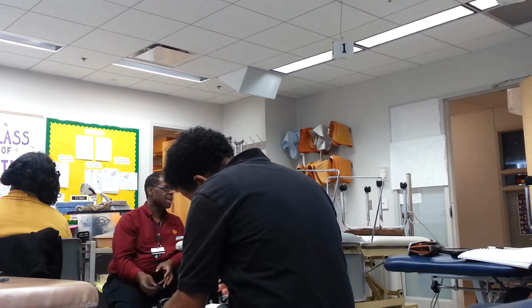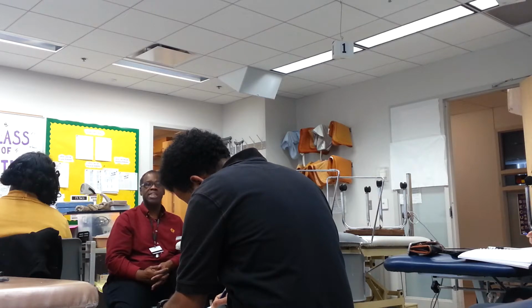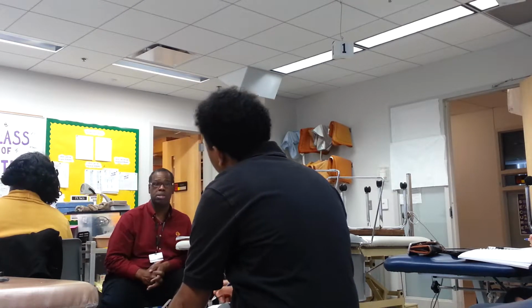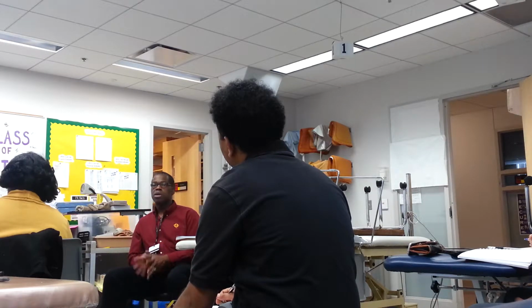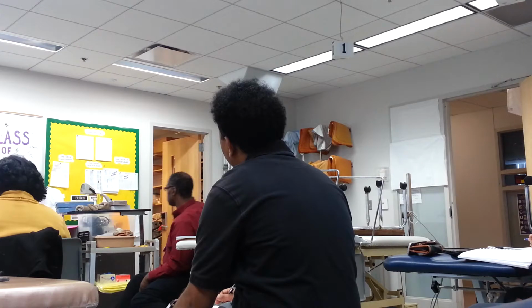Okay, your patient has anterior tibialis weakness. All right, you got anterior tibialis weakness on the practical. Where do we go? As soon as we get that weakness, I need to grab a machine.